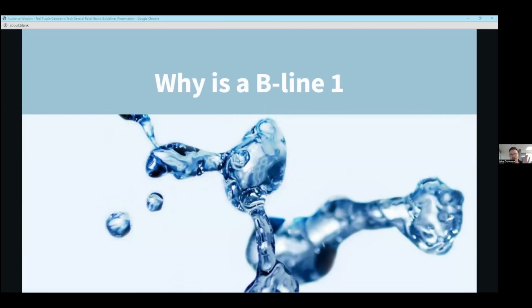So theory number one is you get increased interstitial lung fluid from various causes, whether it's cardiogenic or pulmonary edema. You get this fluid overload in the interstitial space. Generally, our lymphatic system drains that excess fluid, but for whatever reason, it's overwhelmed because there's too much fluid. This causes a swelling of alveolar membranes and the interlobular septa. Remember that from earlier. And the swelling of the interlobular septa provides a tiny acoustic window into the lung.